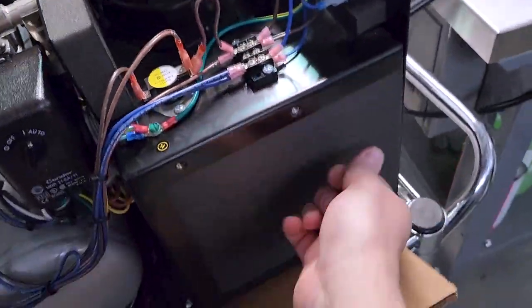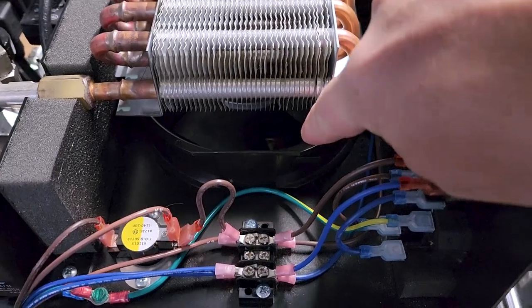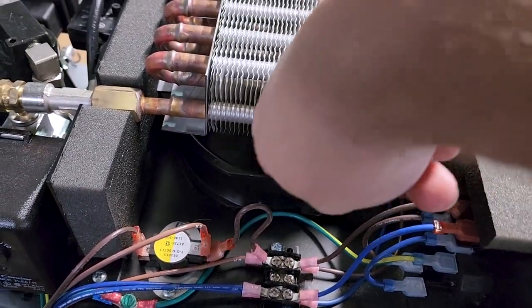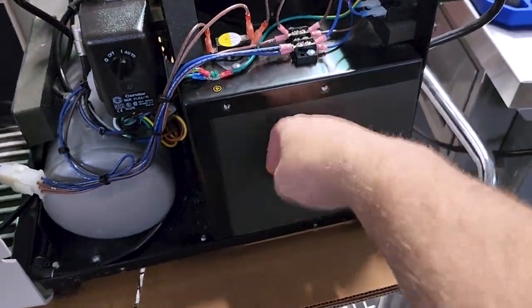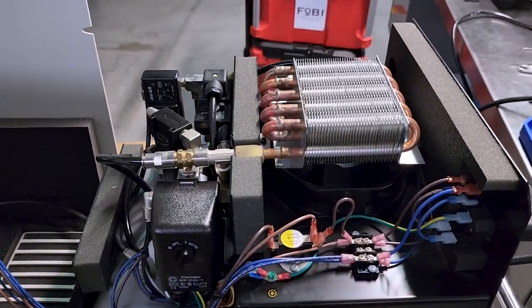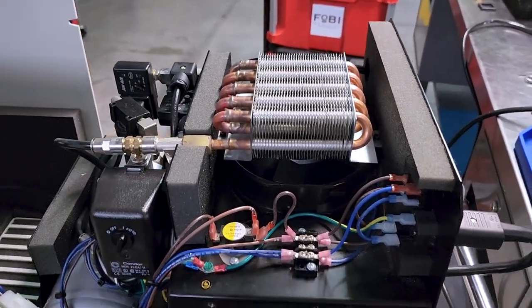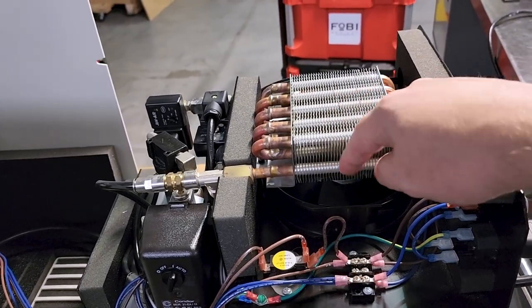And inside this reservoir right here is the actual compressor, and you can barely see it right here. And mind you, these are live wires, so I gotta watch it. So the compressor is housed inside this noise canceling box. And that's because it's ultra quiet. You're talking 40, maybe 50 decibels when this thing's running. It is so quiet. So your compressor's in there, it kicks on.